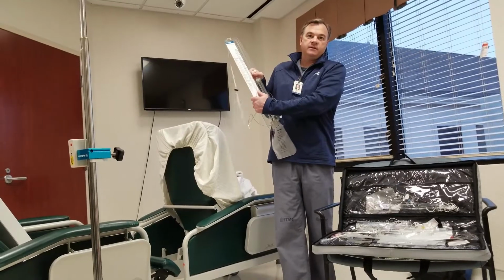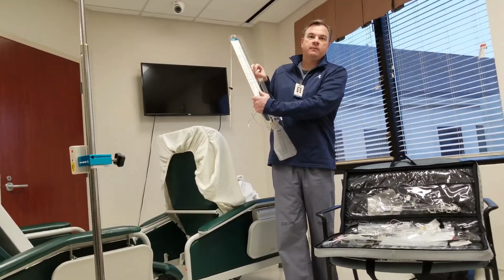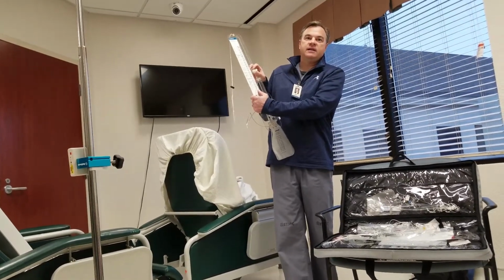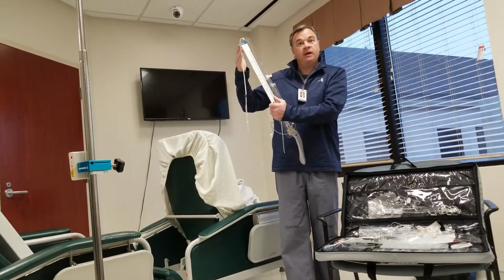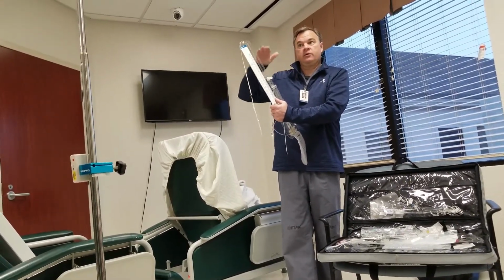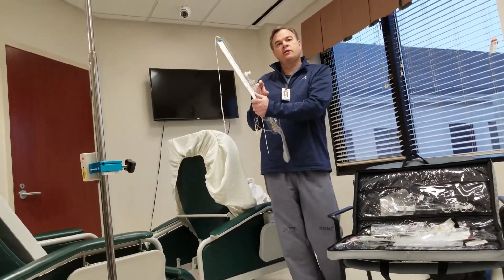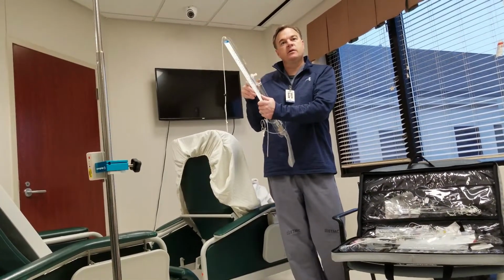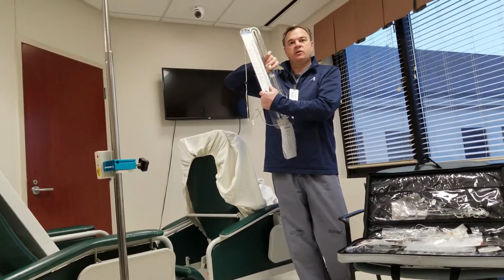It was set at 8 initially. It was put in at 4 o'clock on a Monday, and that night they wanted to see: is 8 too high? Is 8 too low? It was a little bit of a guessing game, like it would be with anything. You're trying to find that sweet spot. So he just wanted to make sure there was enough CSF coming out, but the orders were written at 8, which is what you wanted.